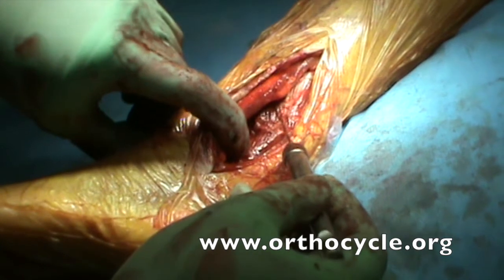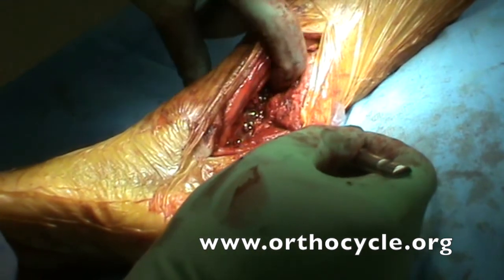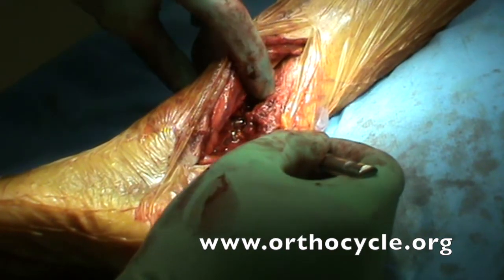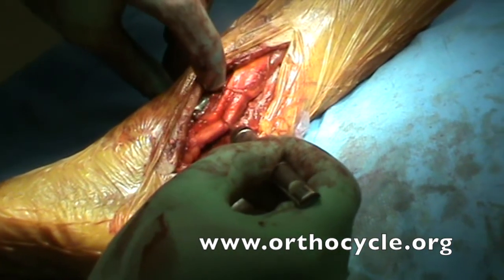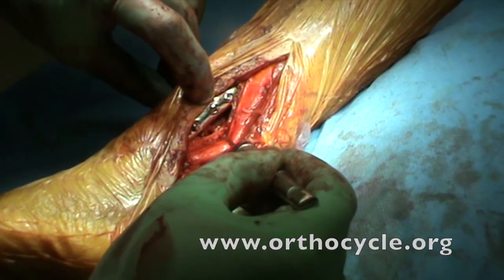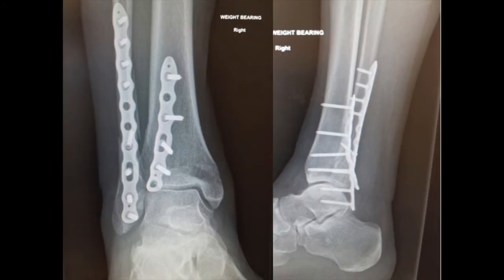Here we can see the peroneal tendon and the FHL — if we split the two, we can see the plate applied to the posterior aspect of the tibia. If we move the peroneal tendon posteriorly, you can see the plate applied to the posterior aspect of the fibula. Here's a postoperative X-ray demonstrating a trimalleolar fracture with a T-plate on the back of the tibia acting as a buttress on the posterior malleolus, and a posteriorly plated fibula which is biomechanically stronger than a lateral plate. I tend now to not use a T-plate on the back, just using a straight plate but again acting as a buttress.